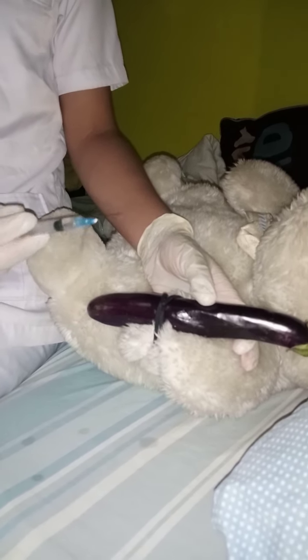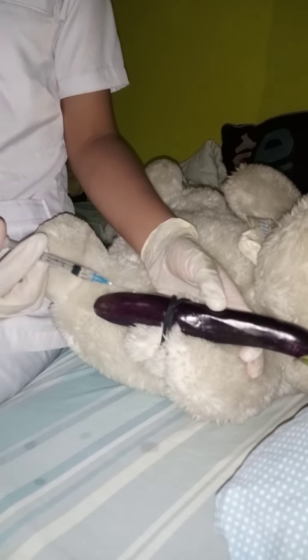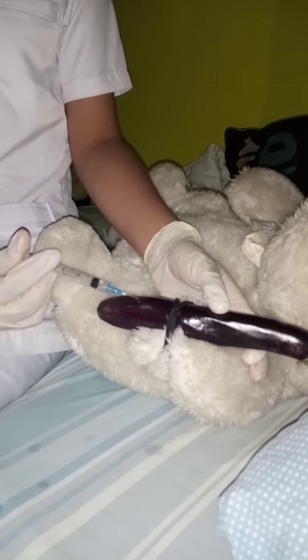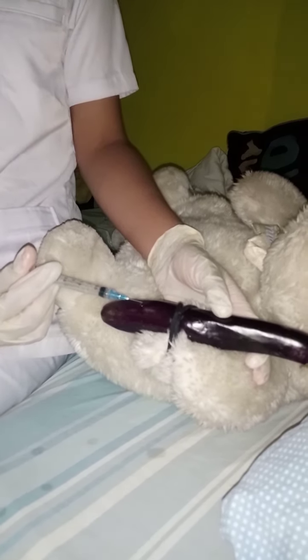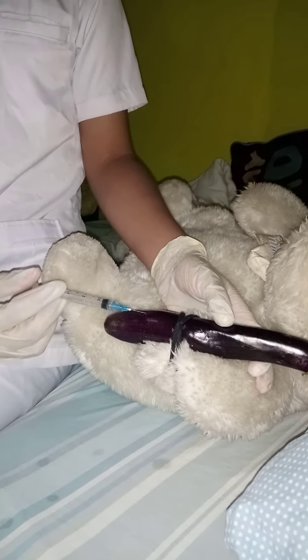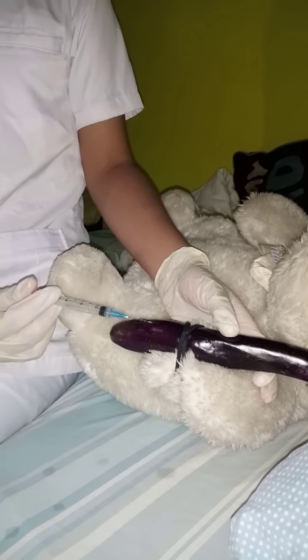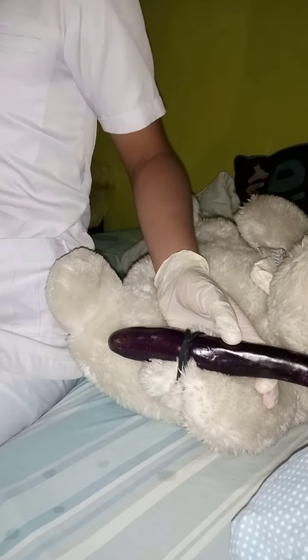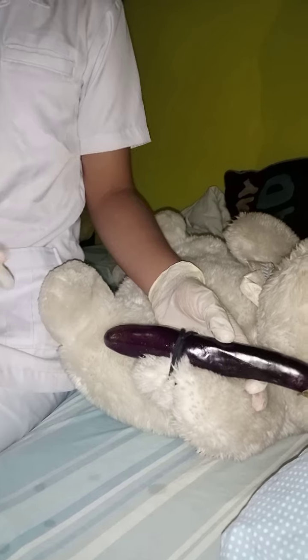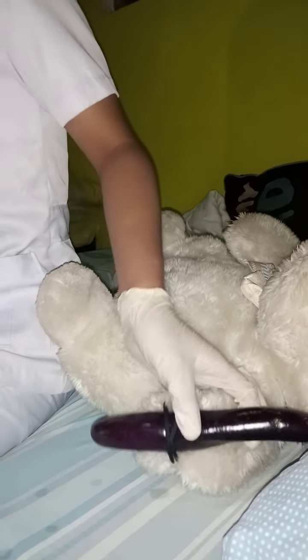So now, sir, I'm going to start injecting. So after that, gently withdraw the syringe carefully at the same angle as it was inserted. After that, activate the needle safety device and apply a bandage if indicated.